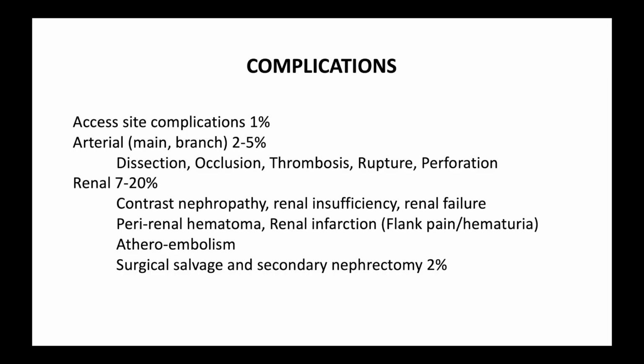You need to be careful with your wire handling. Renal infarction presents as flank pain or hematuria. Atheroembolism is a risk, and in order to prevent that, you use the no-touch technique. And then 2% of cases may require surgical salvage and secondary nephrectomy.